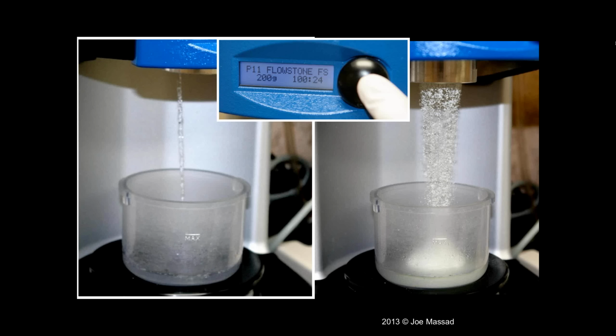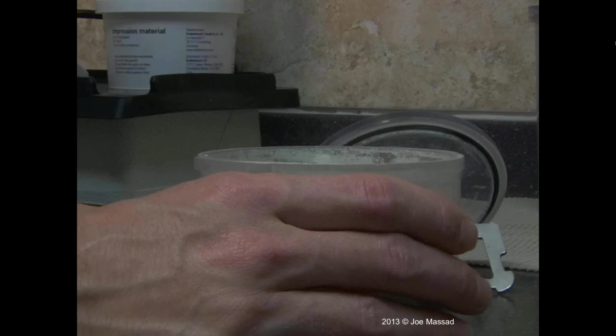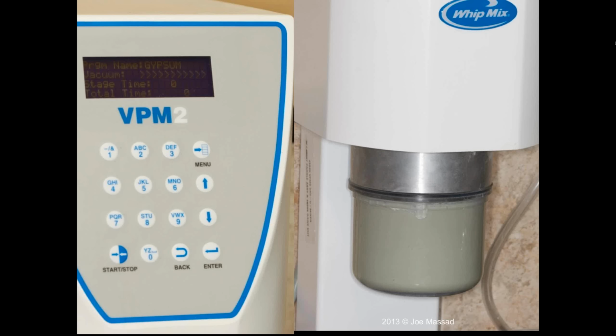I'll just lightly stir it and then immediately put it into my VPM2, and I will then spin it. There is a recommended spin time and a recommended speed. I think we all need to really adhere to the manufacturer's recommendations because we want to get the best fluid material that we can that will set up to accuracy. So you see, we're just pouring it.